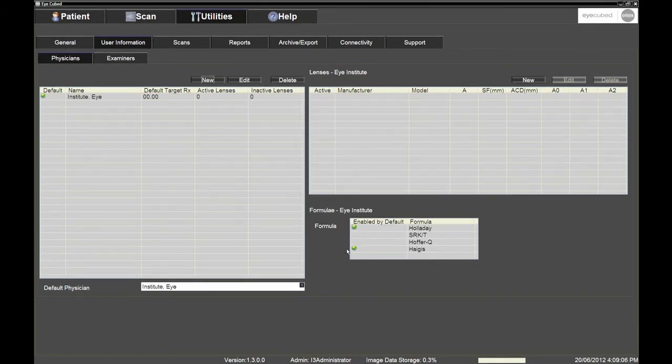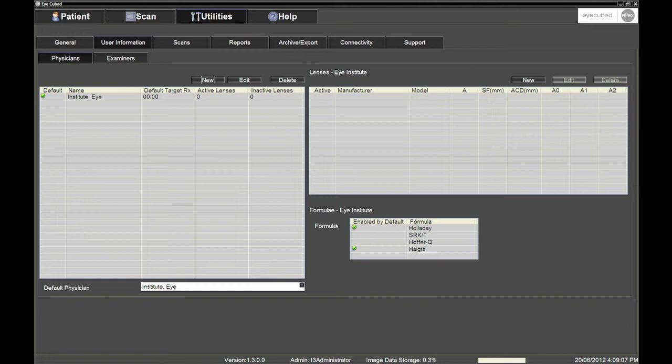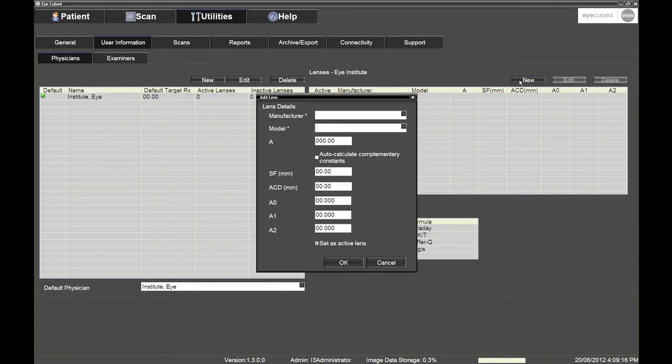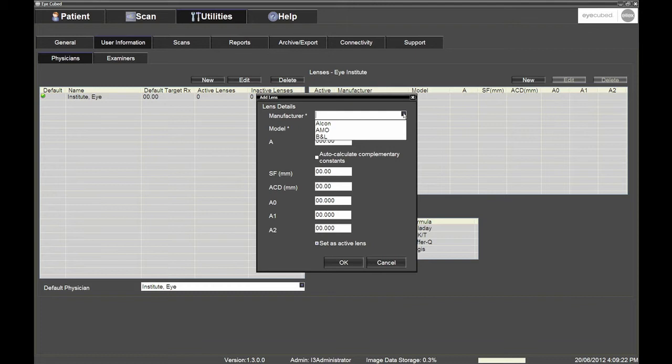You will then need to enter the lens details for all the IOLs that the clinic or hospital use. To proceed, first ensure that the name that you have just entered in the Physicians table is highlighted in blue, and then click the New button on top of the Lenses table, located on the right-hand side of the screen.